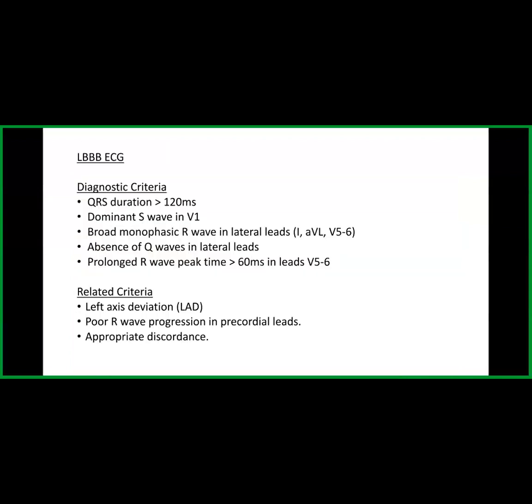Now that we have the general idea of a normal ECG and what it comprises, we will quickly go into our main topic for today, which is a left bundle branch block. How does a left bundle branch block present itself on an ECG?